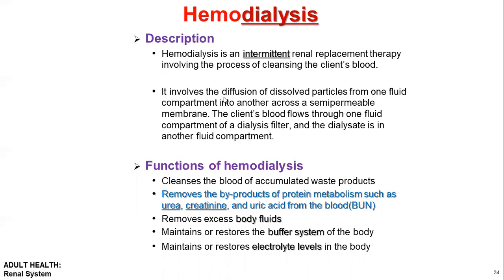It involves the diffusion of dissolved particles from one fluid compartment into another across a semi-permeable membrane. The client's blood flows through one fluid compartment of a dialyzer filter, and the dialysate is in another fluid compartment.